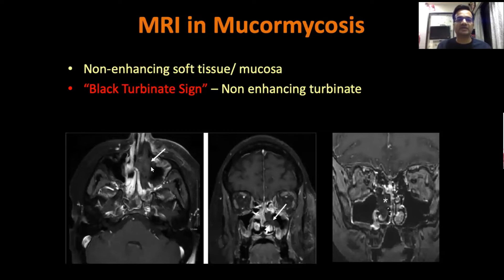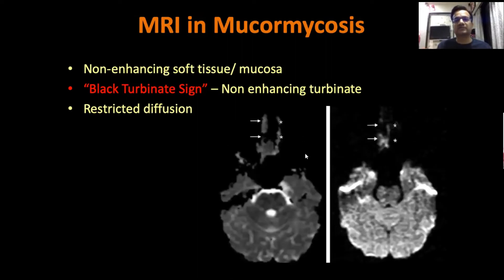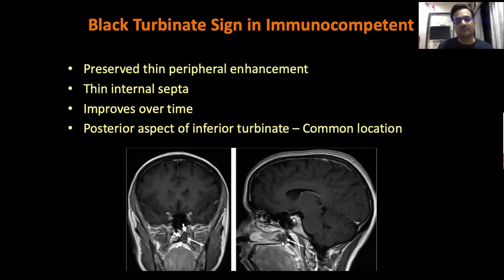This is another example where the turbinate is entirely necrotic and non-enhancing — that is the black turbinate sign. Remember, diffusion restriction can also help; always run the diffusion scan when doing MRI for this purpose, as diffusion restriction is also seen in mucormycosis cases. However, the black turbinate sign is not entirely specific to mucormycosis — it can be seen even in immunocompetent cases, but with a slight difference. In the earlier example, the entire turbinate appeared black and non-enhancing. In immunocompetent patients, typically only the posterior aspect is involved rather than the entire turbinate, and it may even be bilateral.